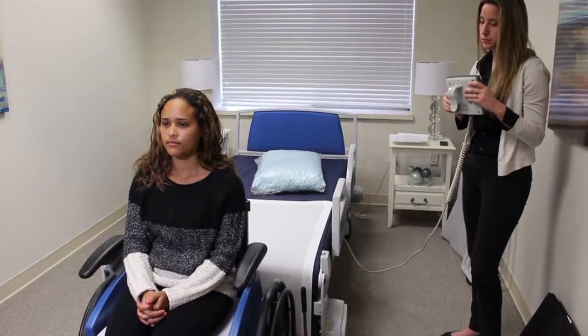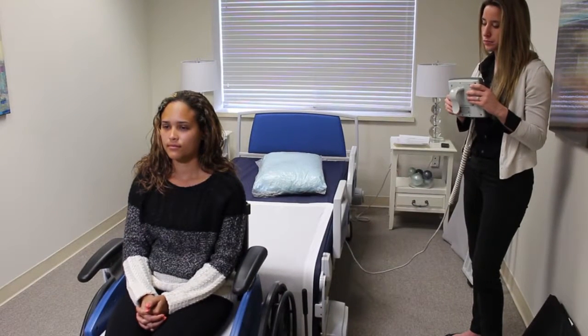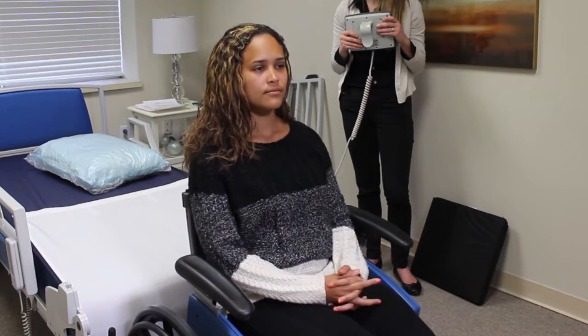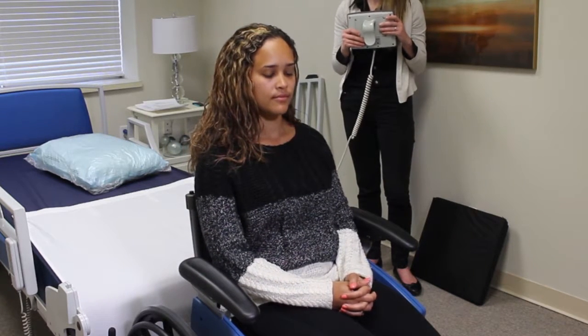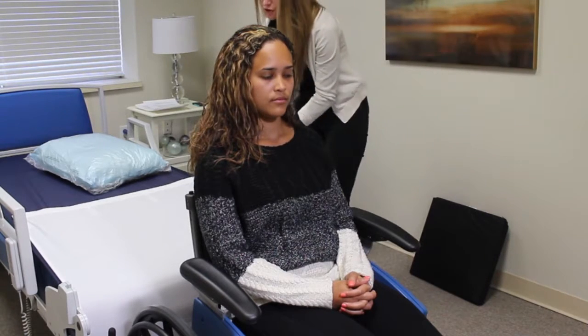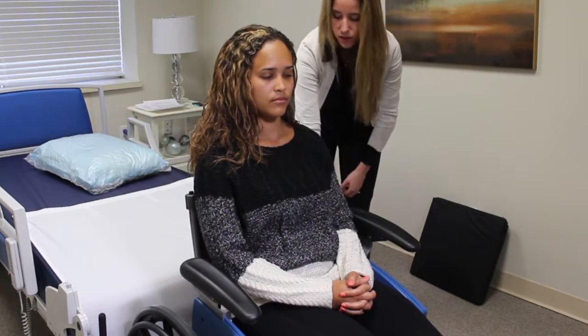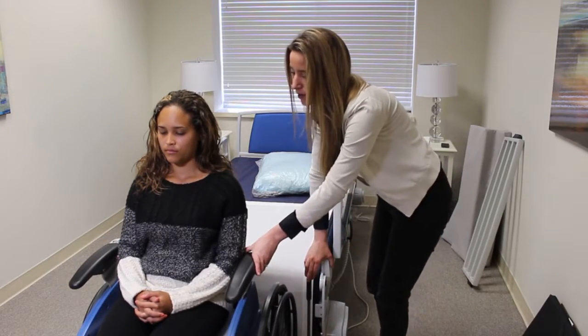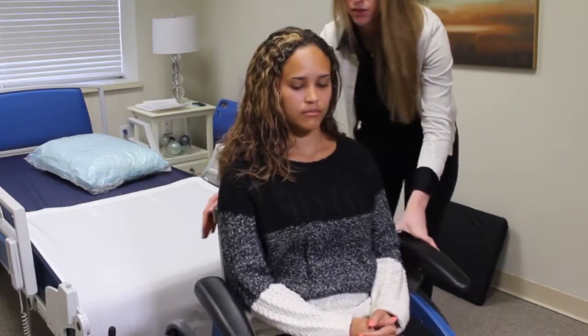Now you lift the chair. You're prompted to lift the chair release lever, and you pull it back.